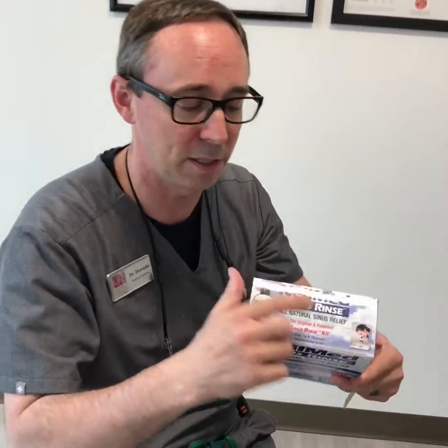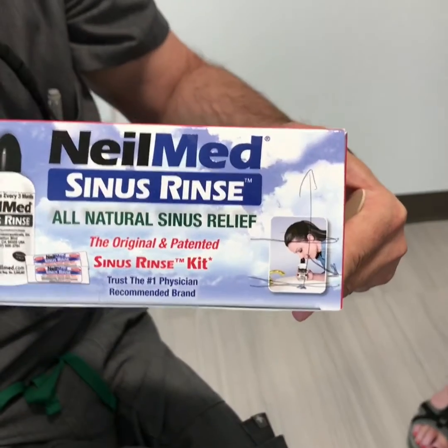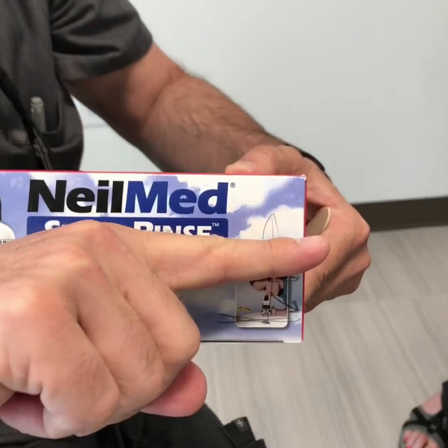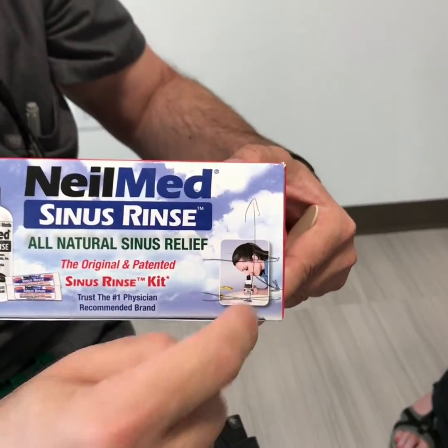So of all the pictures on this box, the only picture I find of any use is this one. This is a picture of a lady irrigating her nose. There are three things about this picture we find to be useful. One is that her head should be parallel with the countertop, so she's looking straight down at the drain in the sink.